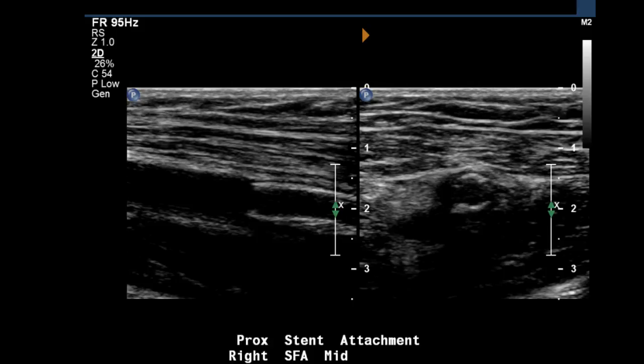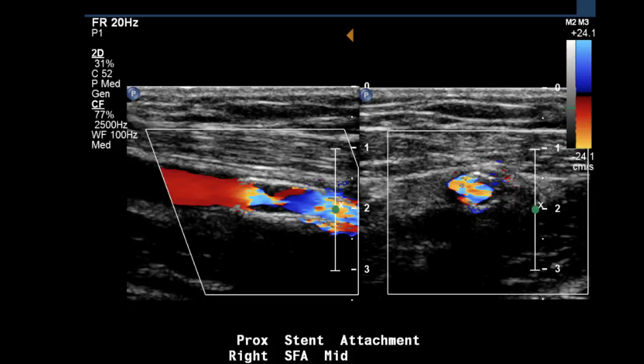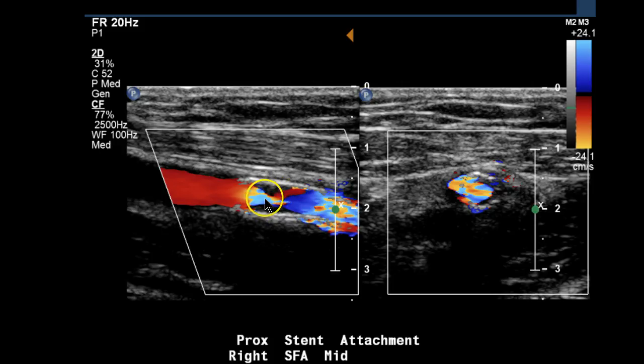The next image is of the stent attachment. Notice the 2D image appears normal — nothing to be concerned about so far. We get to the next image here, and we see the color image essentially gives us the reason for concern — the reason for the waveform we obtained in the inflow artery.